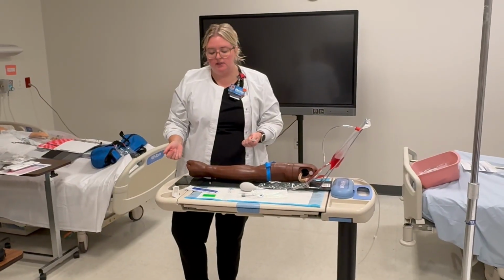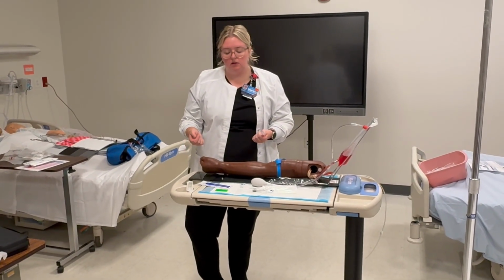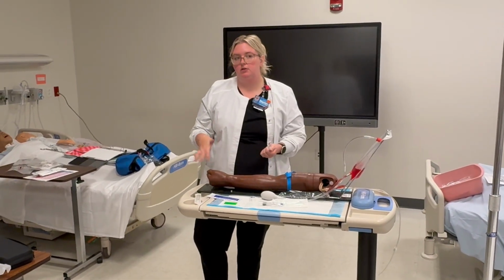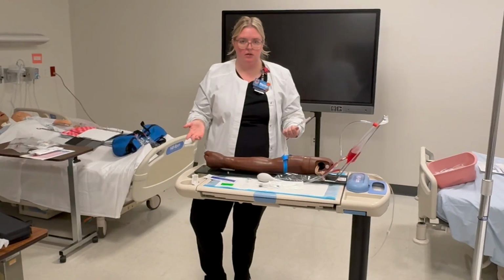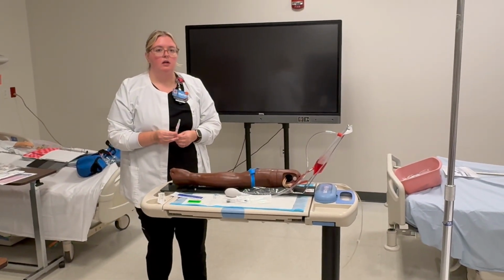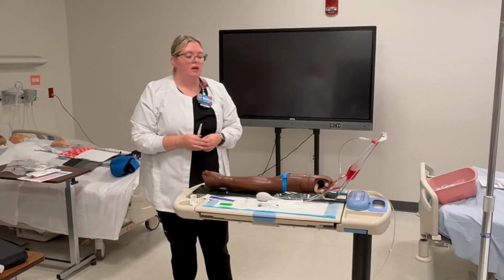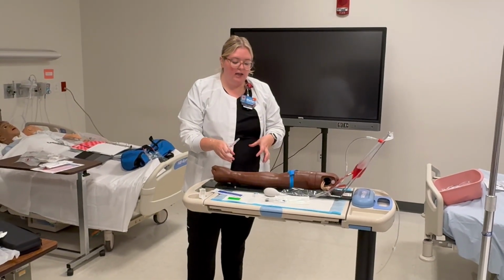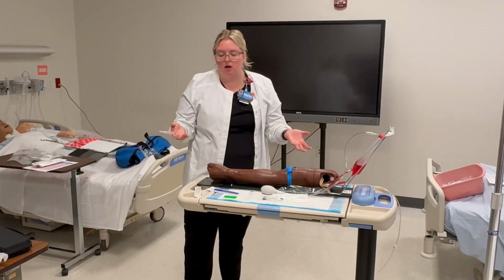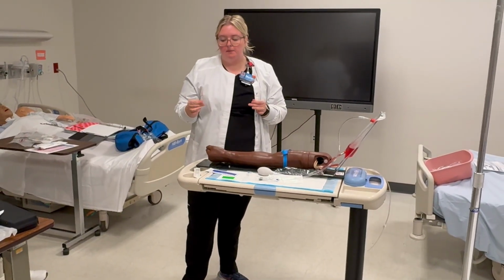You will see nurses repalpate, and just know that you will develop your own skill once you get to do this. This is like the basic, the most by the book. Does that make sense? And in real life, you'll see nurses put on the tourniquet just once. You won't see them take it back off, get set up, then do it again. Yes, usually you put it on, you're looking, okay, it stays on. You don't want it on for a long time because it's uncomfortable, but then they set up their stuff and they go. Okay. So, IVs out of the package.